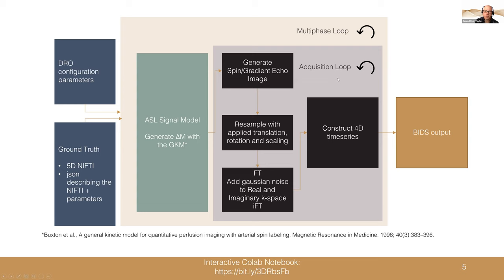Now, one of the things about ASL is that there are lots of different flavors from all the different vendors. So we've built this in such a way to be very flexible to all the different ways that the parameters and the image volume orders and things like that can appear. So it's very configurable with the input parameter file.